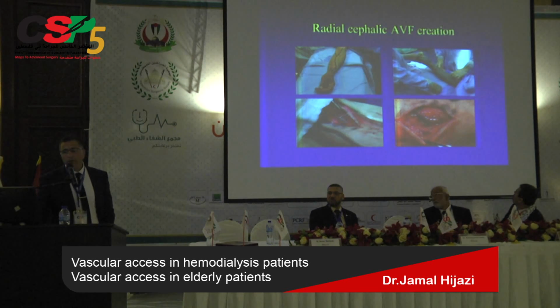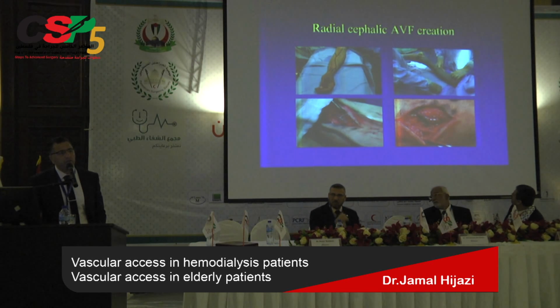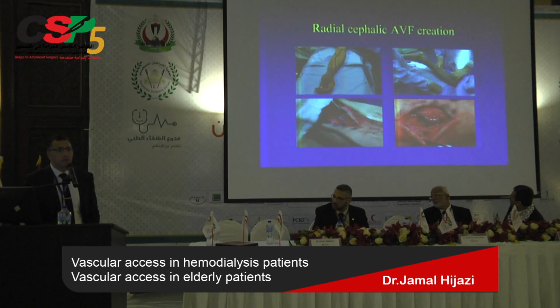Okay, here's an example of cephalic access creation. In general, we do all our fistulas under regional anesthesia. We do supra and infraclavicular block, also locally. There's no need for general anesthesia for this patient.